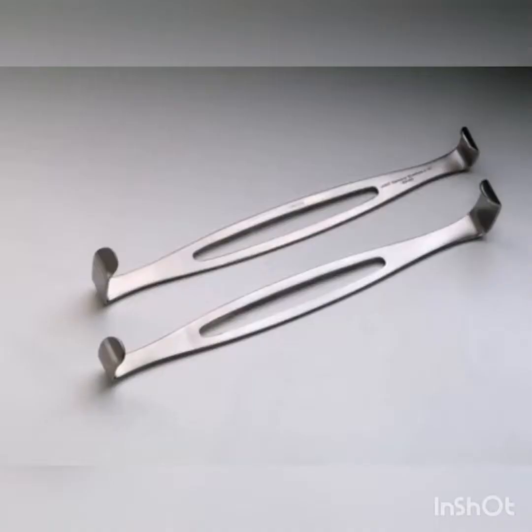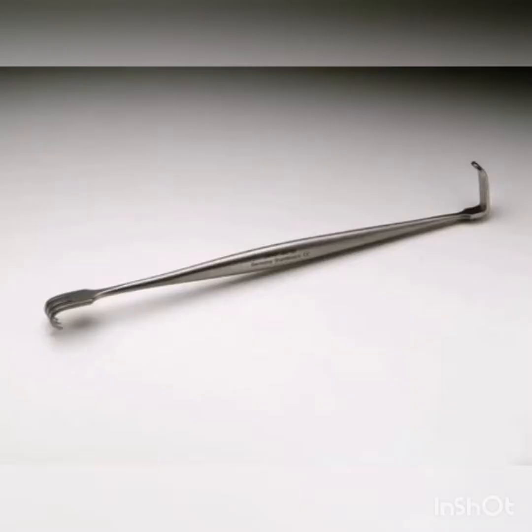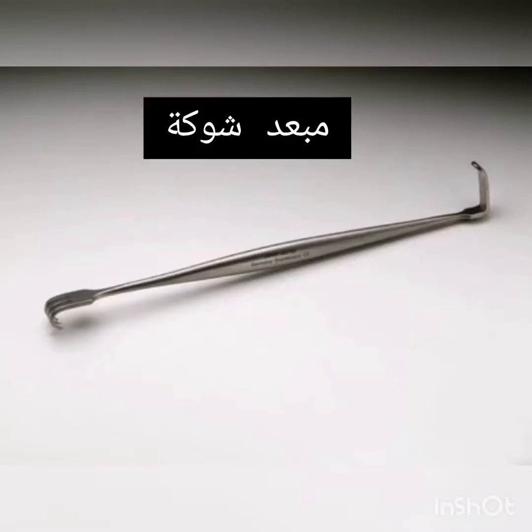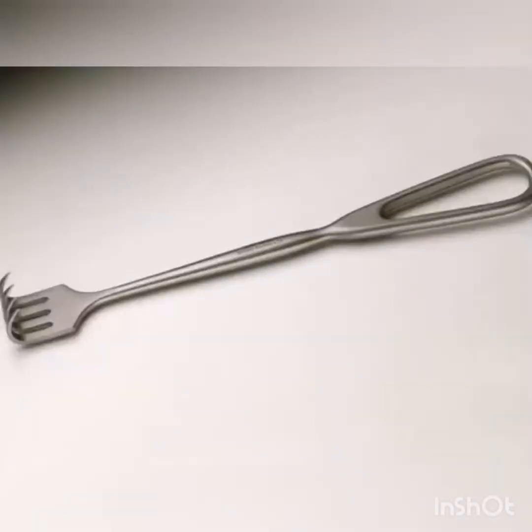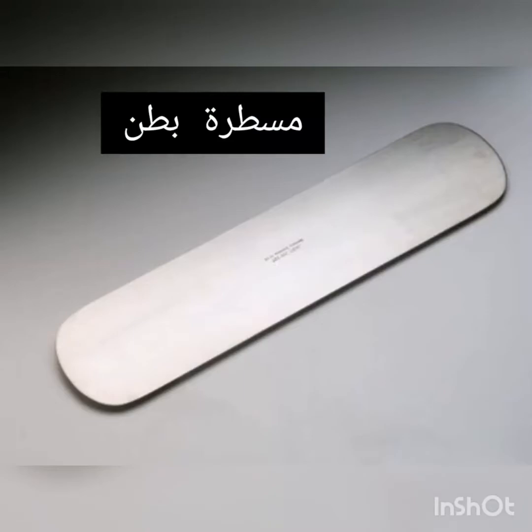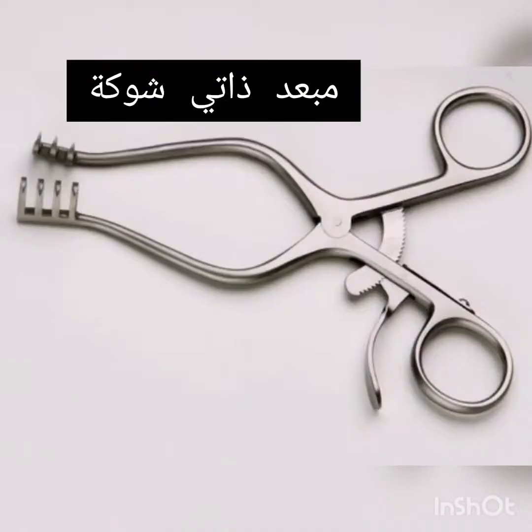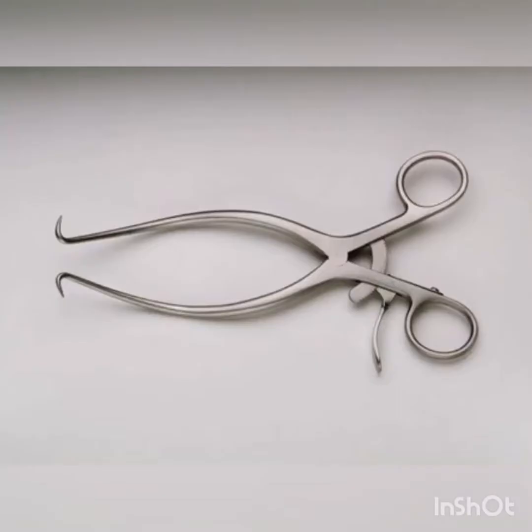Army Navy Retractor. Senn Retractor. Volkman Retractor. Ribbon Retractor. Weitlaner Retractor. Gelpi Retractor.